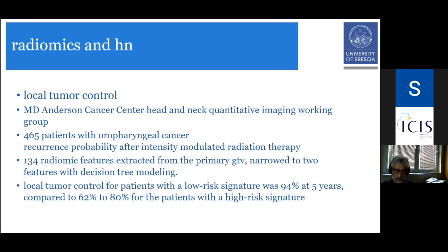So this is interesting clinically, and it's even more interesting, in my opinion, from a logistic point of view, because in this center, many patients are treated with radiation therapy with an MRI-guided linear accelerator. What is interesting is that there are almost 50 such machines all over the world, and all these 50 machines are connected by a scientific network.